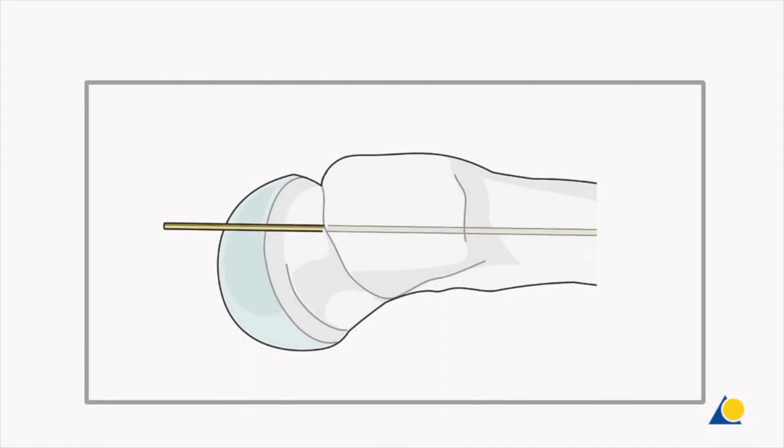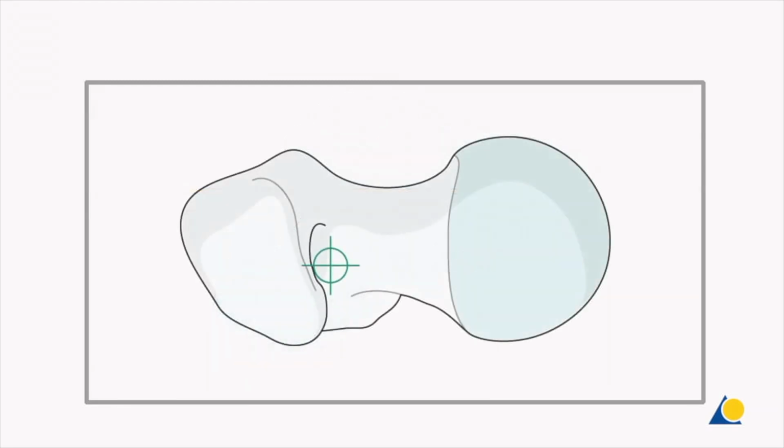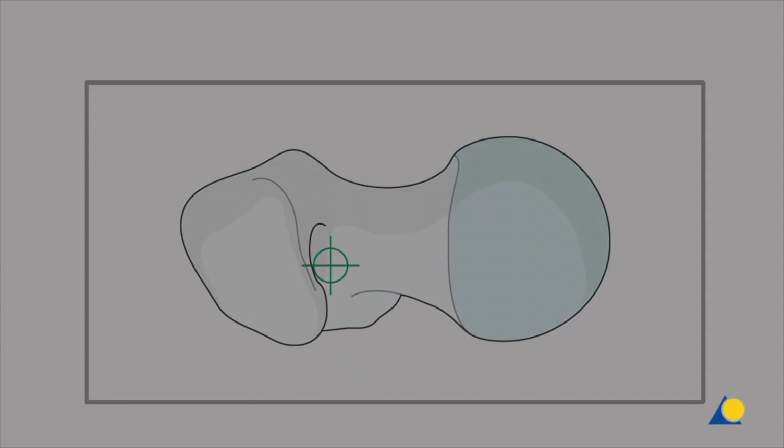The entry point for the retrograde antegrade femoral nail is in line with the medullary canal in the AP and lateral views. The entry point is posterior in the proximal femur in the piriformis fossa, but varies with patient anatomy. The entry point determines the optimal anatomic position of the nail in the medullary canal. The RAFN nail insertion should not be attempted without the identification of the correct entry point.